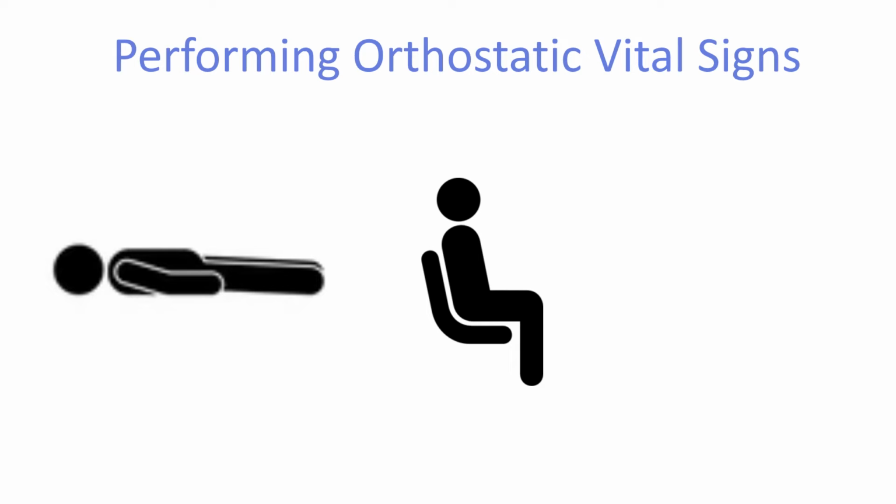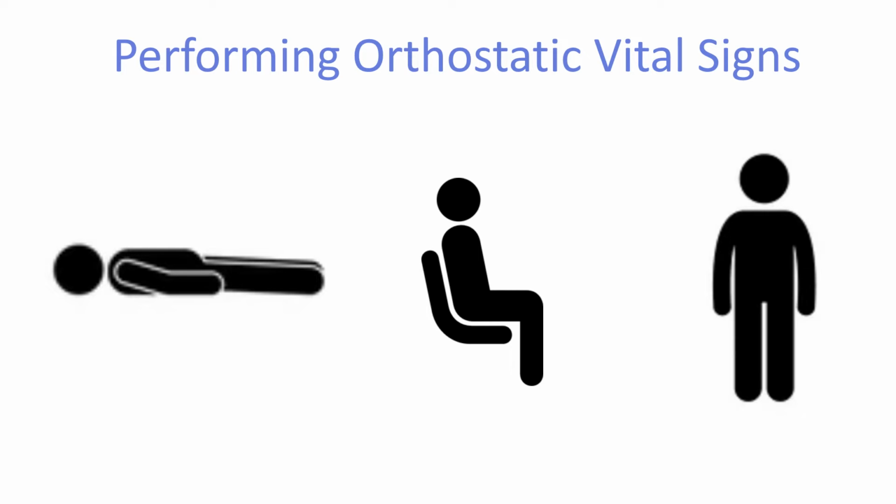If the patient has symptoms associated with this position change, or if the sitting blood pressure is less than 90/60, stop the test. Ask the patient to stand. Ask again about dizziness, weakness, or visual changes associated with this position change. Note sweating or paleness. The patient should be permitted to resume a lying position immediately if they feel weak, as if they're going to faint.